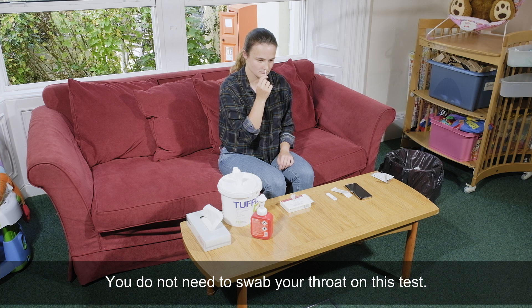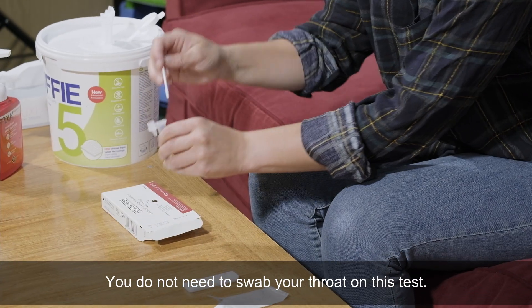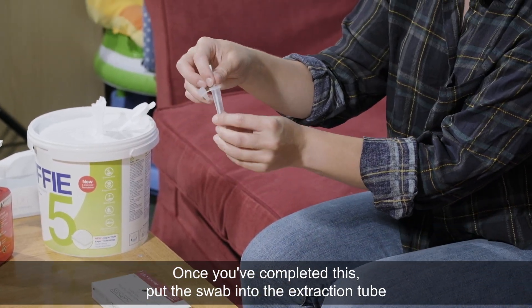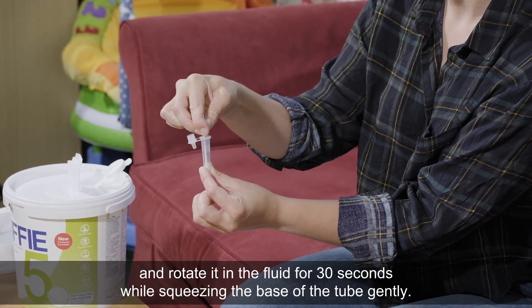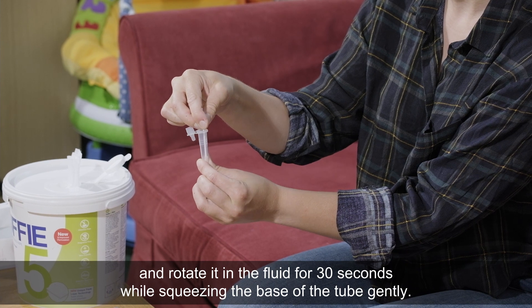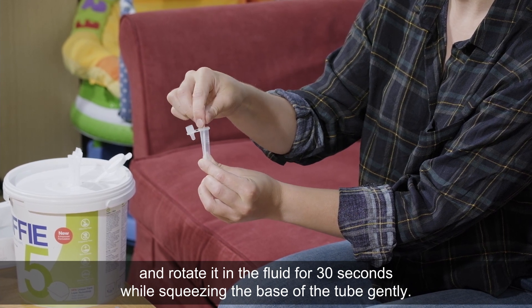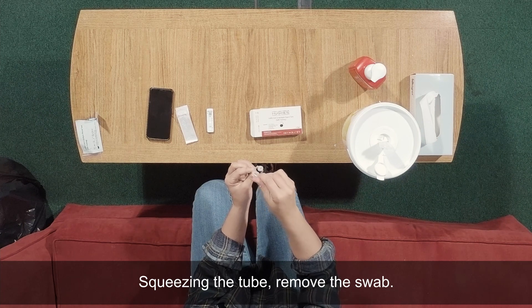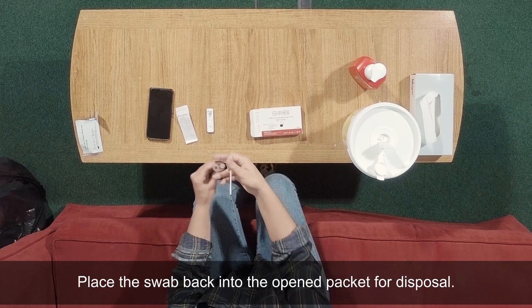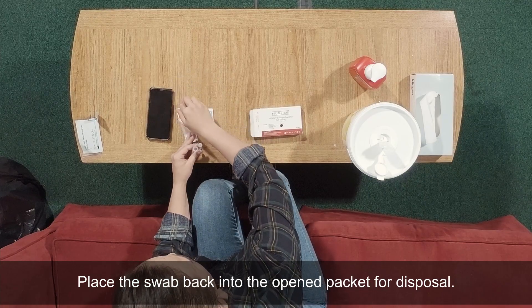You do not need to swab your throat on this test. Once you've completed this, put the swab into the extraction tube and rotate it in the fluid for 30 seconds while squeezing the base of the tube gently. Squeezing the tube, remove the swab. Place the swab back into the opened packet for disposal.